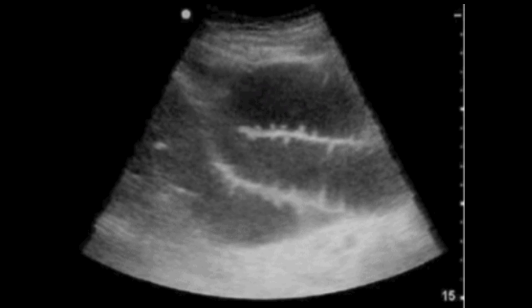With bowel obstruction, you will see that there's lots of peristalsis, and the content is going through the loops and then coming down back again. So it's constantly doing this seesaw type of picture. Then there's bowel obstruction because it's not moving through. Despite the peristalsis, if there's peristalsis, it should be moving forward. So bowel obstruction is actually quite easy to see, especially small bowel, because there's fluid in it. There's no air in it.